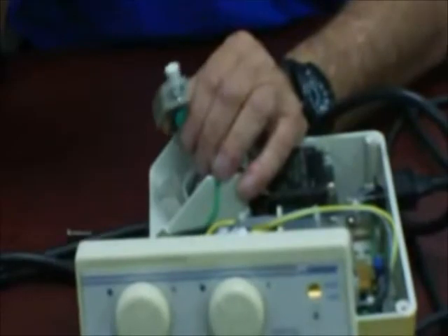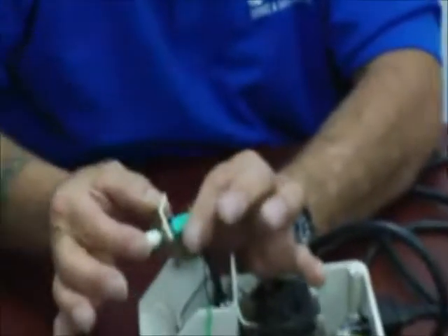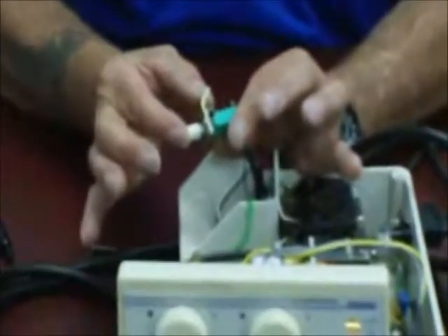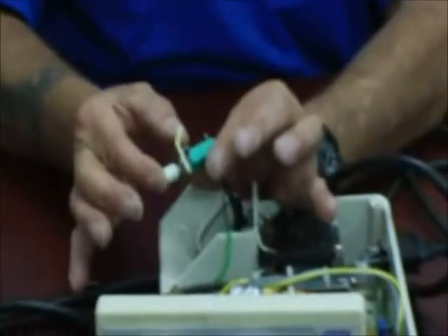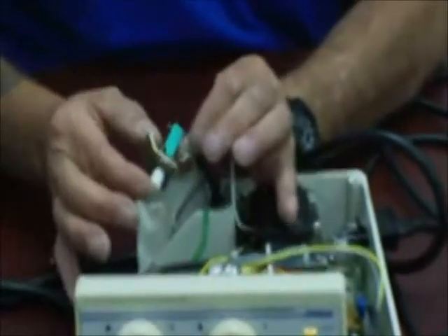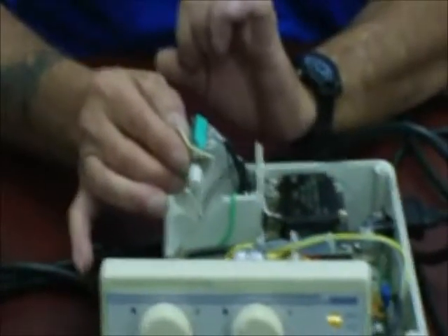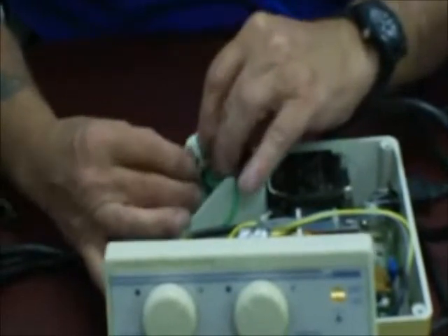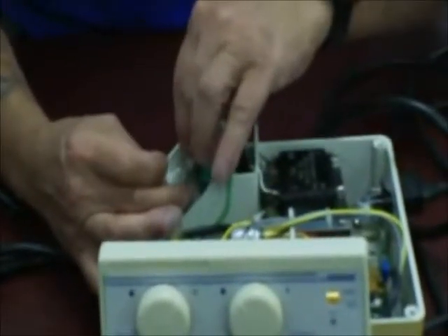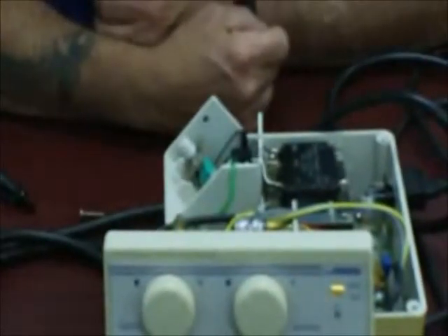If the switch still sticks after removal, go ahead and order a new switch and replace it. You will need your soldering skills for this. This is all designed to help you retain a little bit of your repair money.